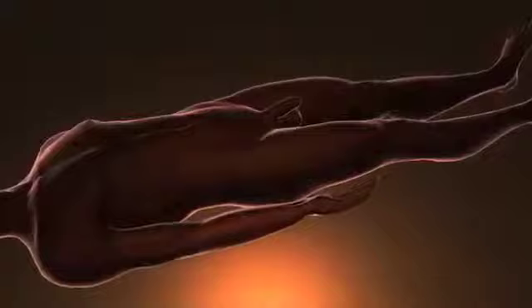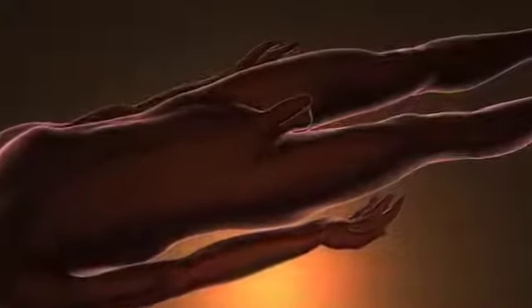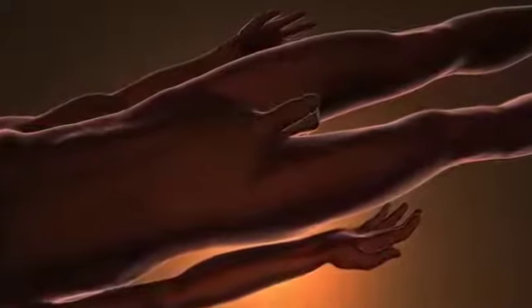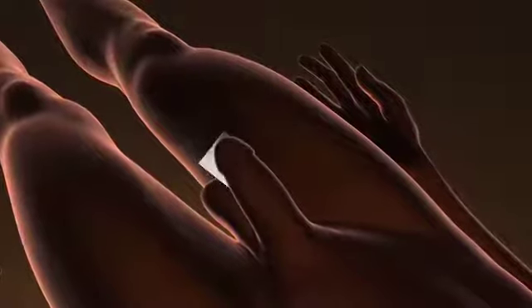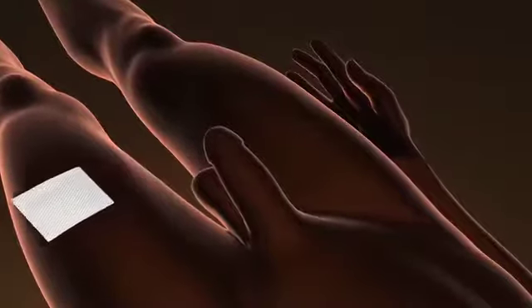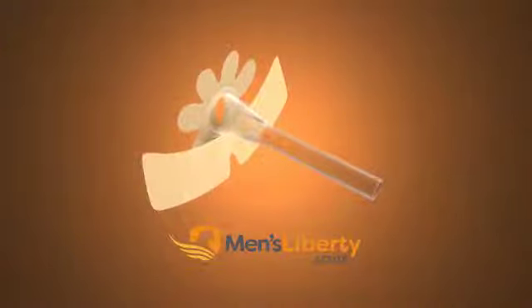First, make sure that your patient's anatomy is clean and dry. If you're currently using bathing wipes and chlorhexidine wipes that contain moisturizers and emollients, please make sure to dry the tip of the penis with a towelette as much as possible prior to applying Men's Liberty Acute. Absorbing the moisturizers from the skin prior to application will increase wear time of Men's Liberty Acute.